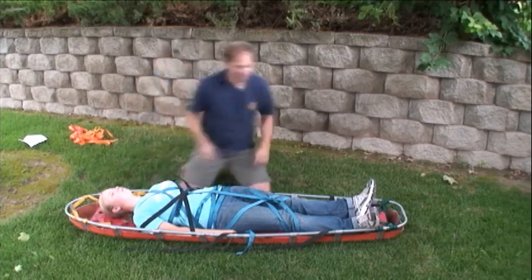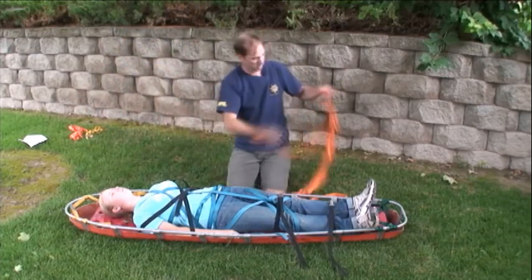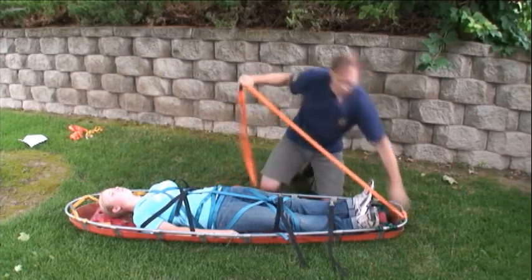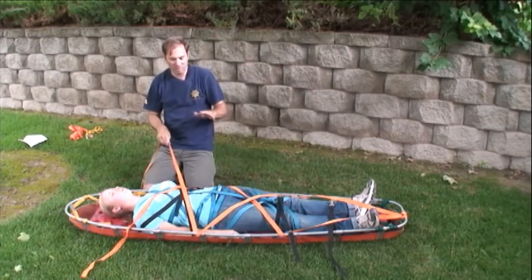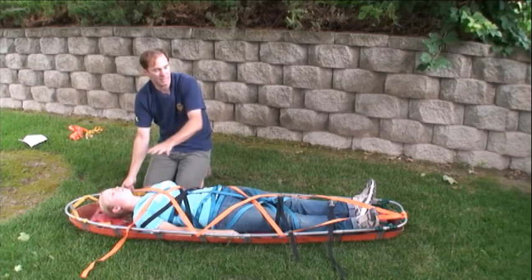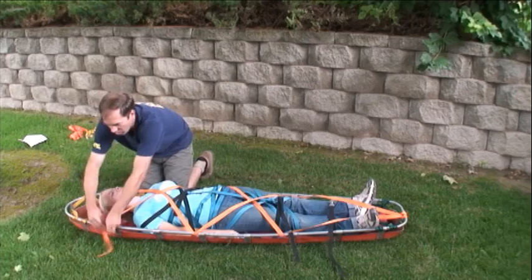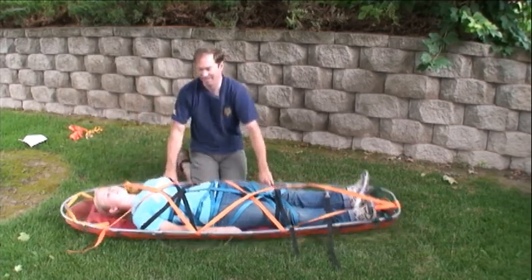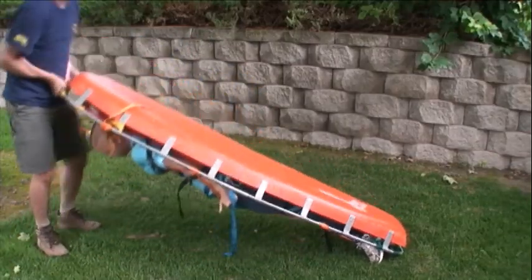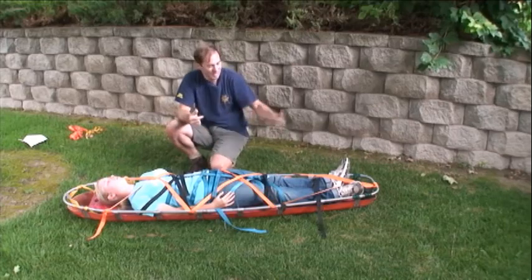Strap your patient in, but once again, don't trust those straps to hold them down — add some webbing lashing. Do a girth hitch, then crisscross. This time I cross much higher, close to the waist and over the torso, which seems more secure. Finish with a clove hitch. Now we'll replay this several times, progressively faster — try to anticipate what comes next before you see it and get it memorized.